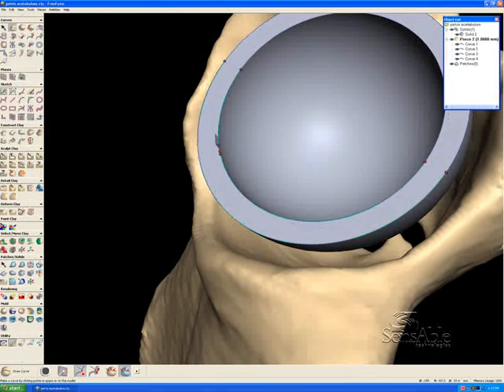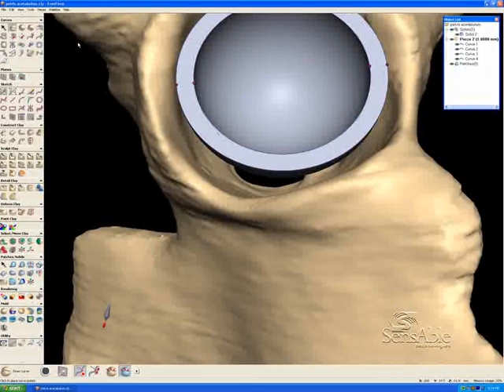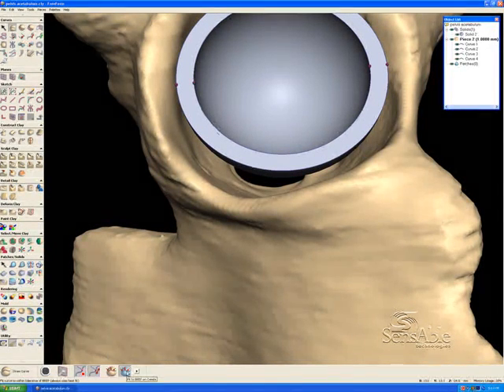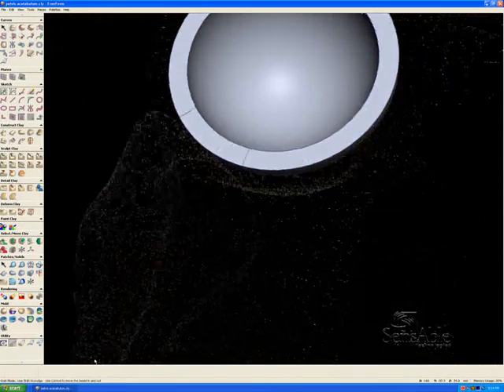And now I have two curves that I can touch, and I physically, haptically, we call it, snap to these curves. So it's very fast to make your way around in the program with the use of touch. I'm also going to specify that these are going to fit to the surface of this solid, as well as split any curves that they come in contact with. So here I'm going to make 1 click, 2 clicks, and 1 click, 2 clicks, and you can see as I highlight these curves here, just by mousing over them and touching them, that there are 4 individual curves now.